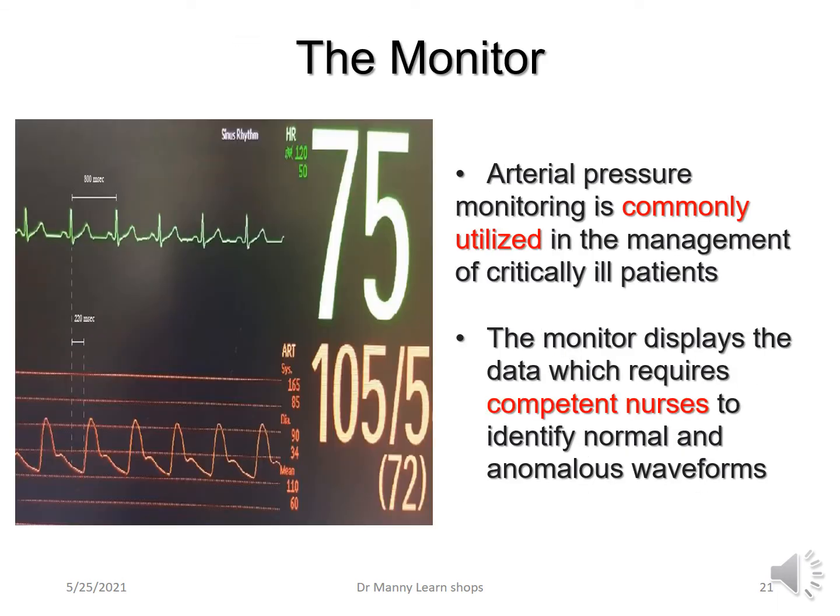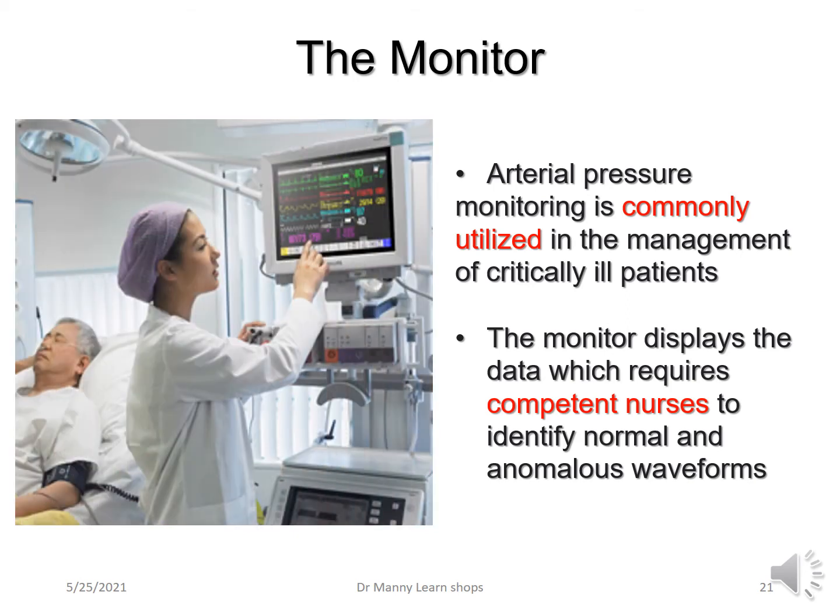The monitor is for arterial pressure monitoring, and it's commonly utilised in the management of critically ill patients, as I said. It's the monitor that displays the data which is required for competent nurses to identify normal and abnormal or anomalous waveforms. Competent nurses, hopefully proficient nurses, are what's required.